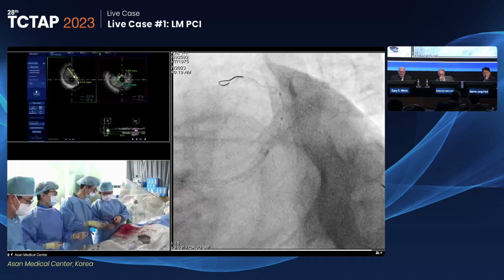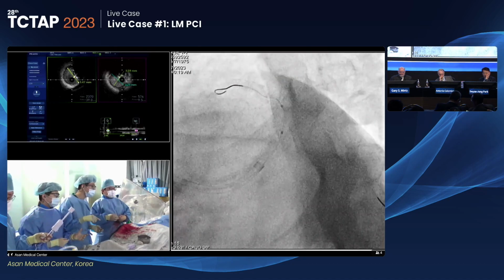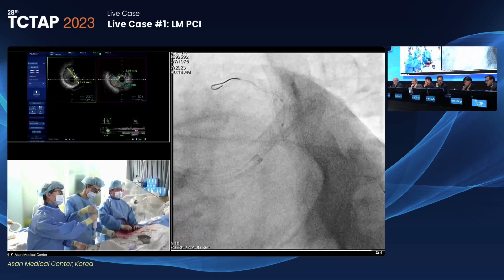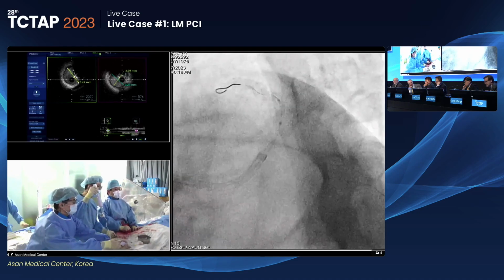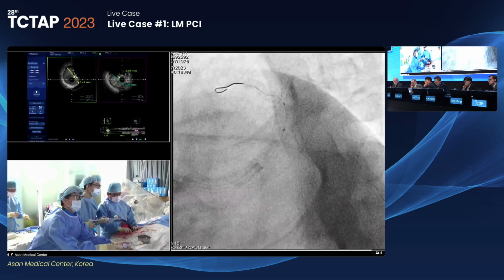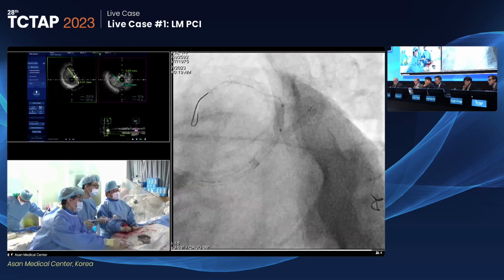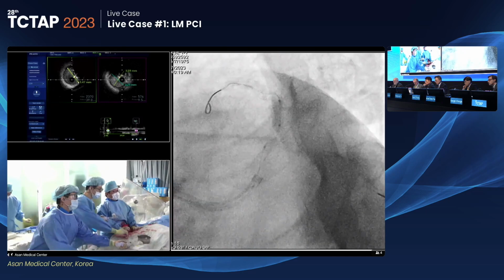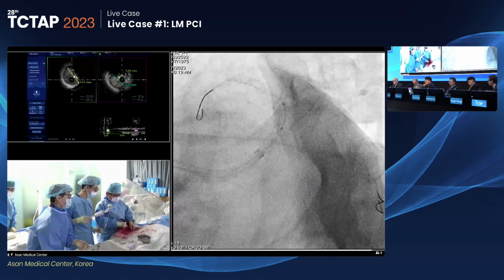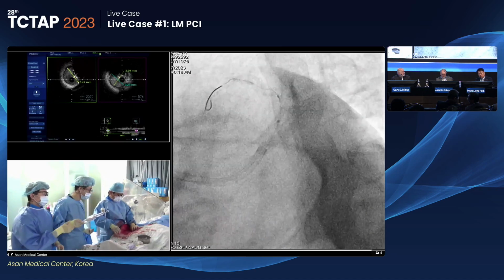Trouble with stenting the ostium, you always have 2 problems: either you have an ostium miss or you have a main vessel protrusion. In order to avoid this situation and taking advantage of the 8 French guide, the circumflex stent and the Ramus stent could have been placed at the same time. Yes, that is a good idea, but the position of the Ramus stent may impact circumflex access now. That's going to be the challenge. The way the balloon is behaving, it's not just ostium circumflex disease. There's something in the way, and it's probably metal, the strut of the stent.